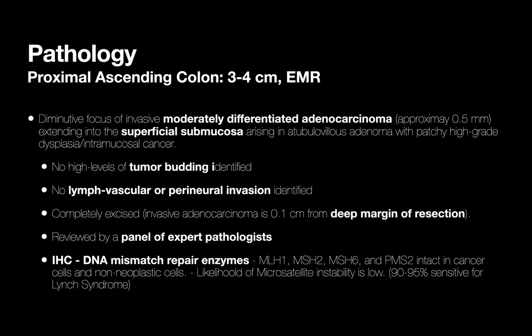So it was good to do en bloc resection, even if the small margins were later removed, but the biggest part was removed en bloc. So I think that was the best decision, because a sessile polyp, unlike the lateral spreading of granular type, which has a risk of submucosal invasion less than 1%, the sessile has a risk of up to 40%.